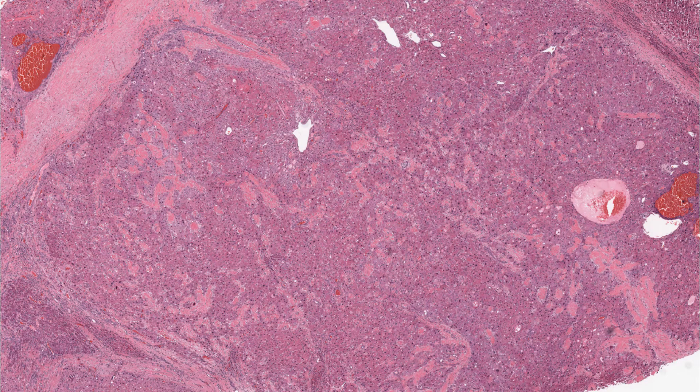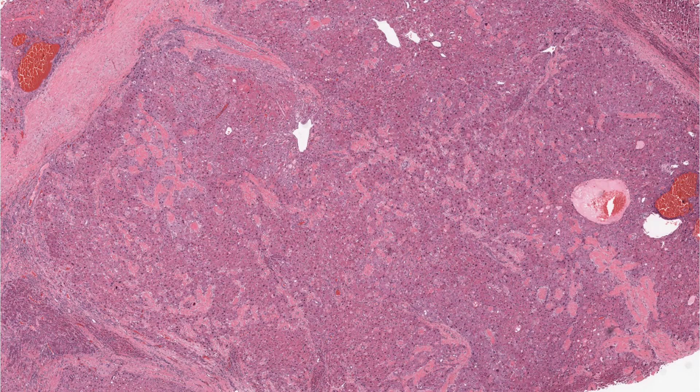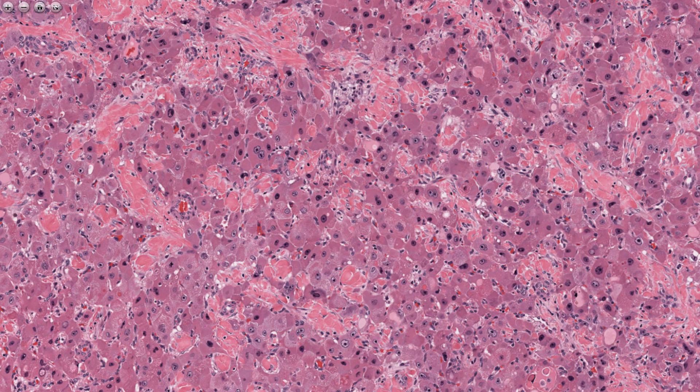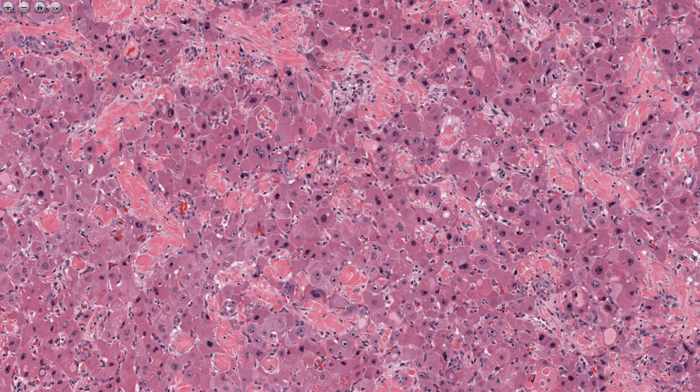Case two at low power: not as much fibrosis as in case one, but there is some fibrosis in a clumpy fashion. This looks like a fibrolamellar carcinoma in the sense that it has abundant eosinophilic cytoplasm and it does have collagen, but is it really lamellar? This is probably fibrolamellar, but I personally couldn't be absolutely certain without looking at the fusion.